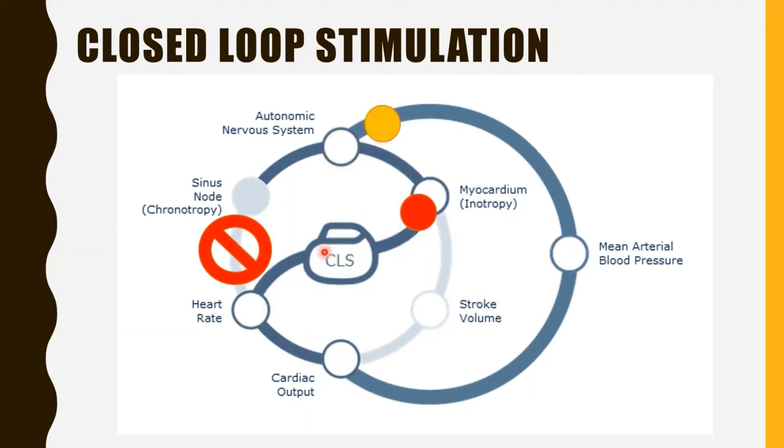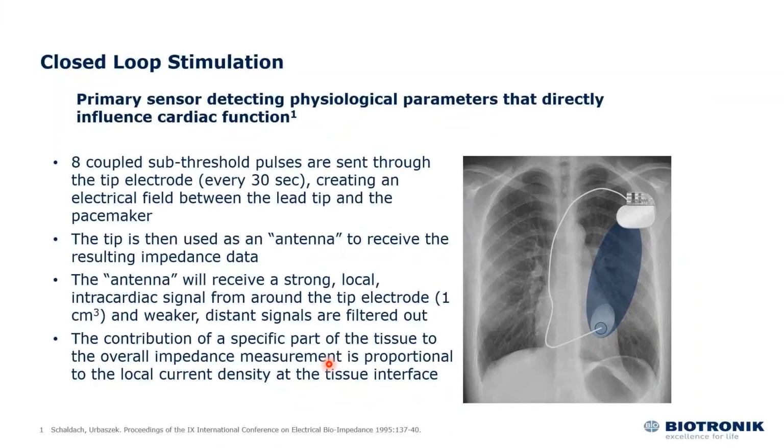So you're really utilizing this CLS to close the loop itself, to ensure that whenever you have physical stress or mental stress, you're still able to increase the contractility of the myocardium and, at the same time, increase the heart rate, utilizing the CLS system.